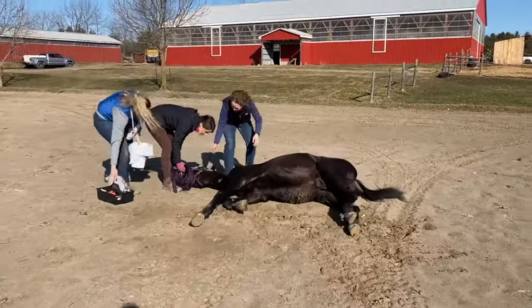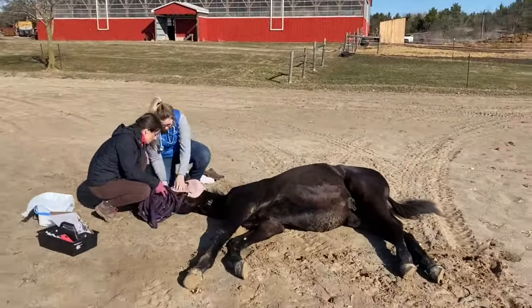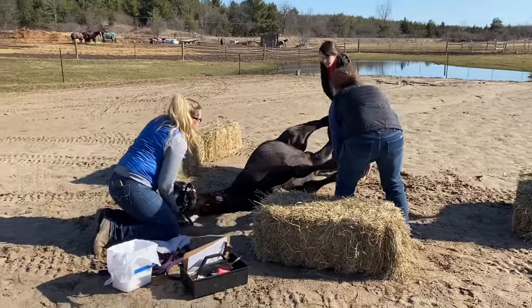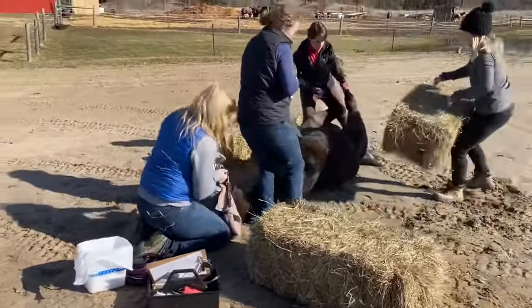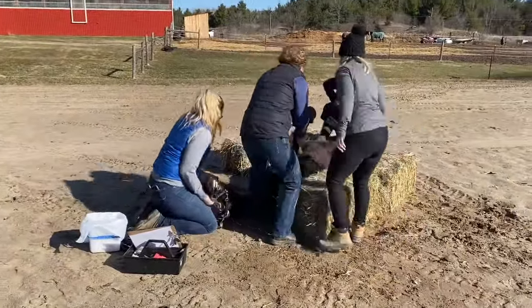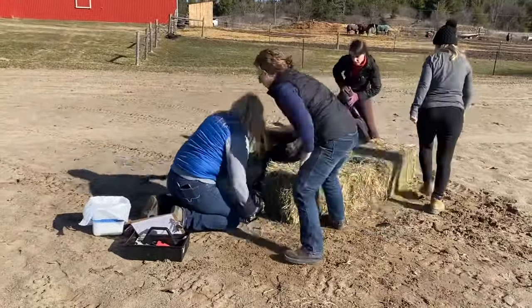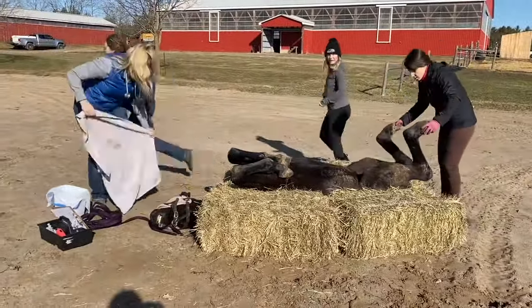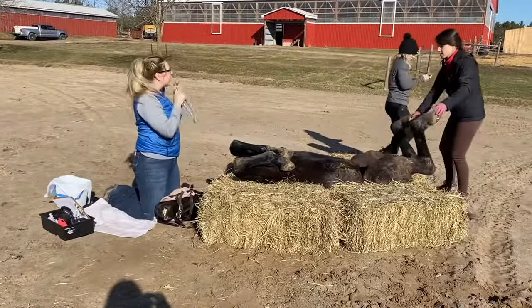Taylor arrives with monitoring equipment and covers to protect the eyes and face during the surgery as Dr. Stephanie and Dr. Christina stabilize Finn into position. There are different ways to do this for an anesthetized horse, all due to the surgeon's preference. We prefer to prop the horse up on their back and stabilize using straw or hay bales, as this allows the surgeons to have an open view of the surgery site.